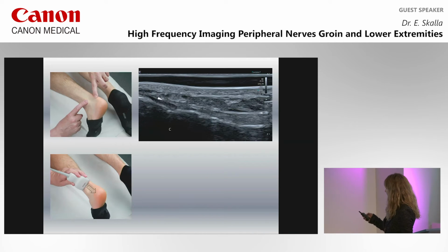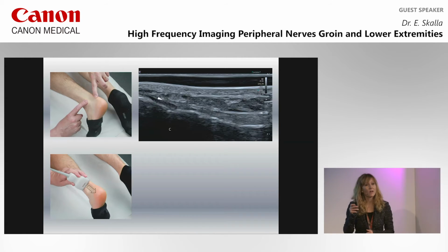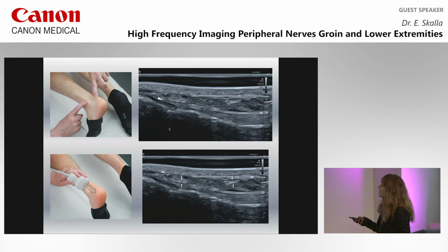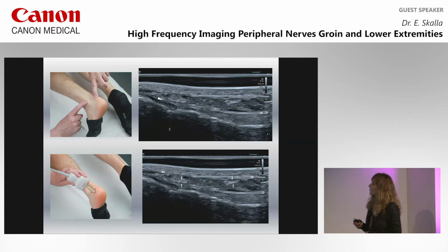So this is the fascia, the muscular fascia. And in contrast to the medial ones, they are now lying really in the subcutis. So we just have to search for some tiny little cross-section nerve areas. There are also a few of them, not only one nerve, and they are easy to find. Just follow them upwards and downwards.